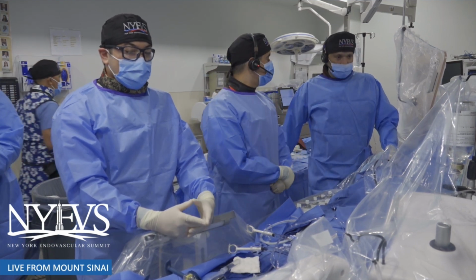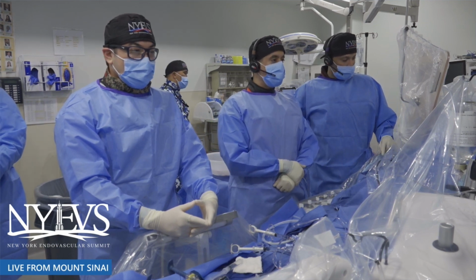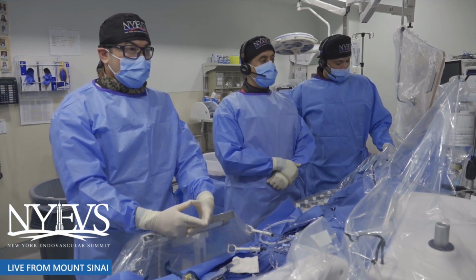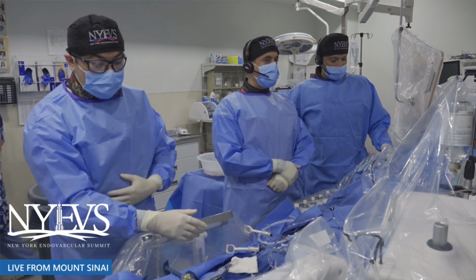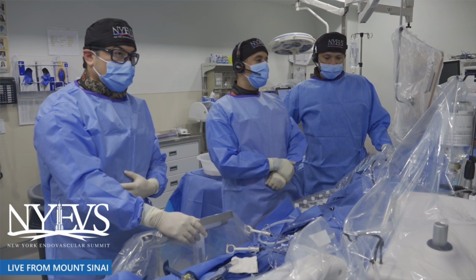Yeah, I think that also applies to the shockwave as well. I mean, the L6 is nice, but it might be overkill in this case potentially. So you could potentially just get away with a couple of covered stents and be done with the case. But I think IVUS will help inform that information.